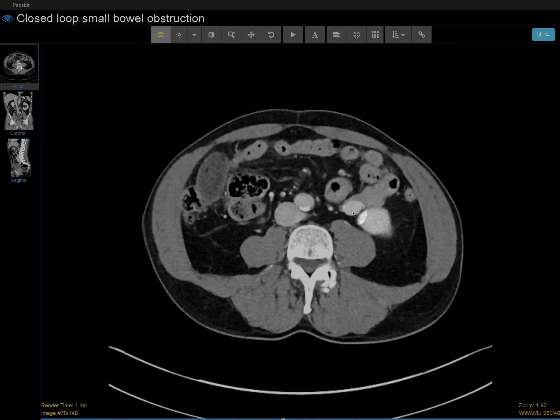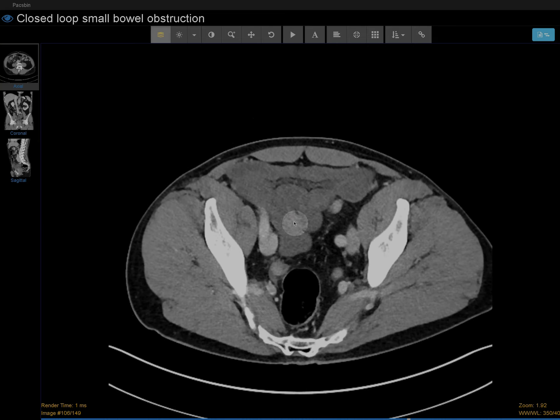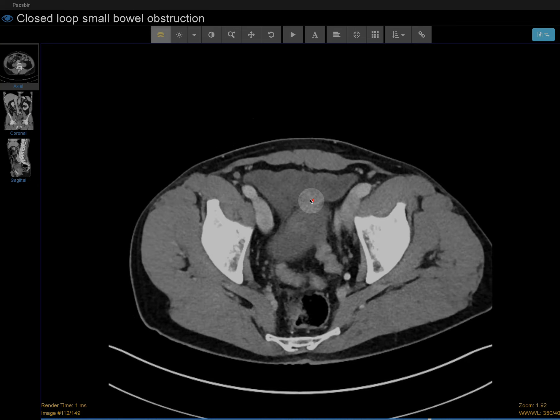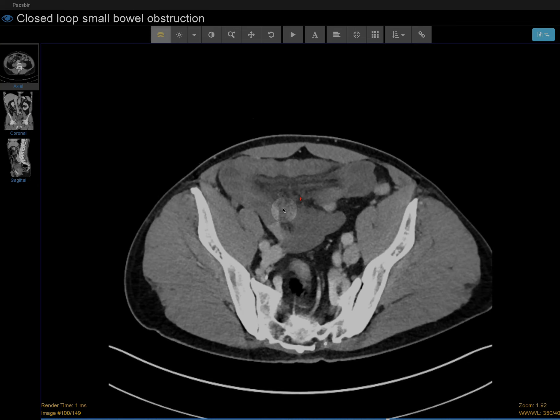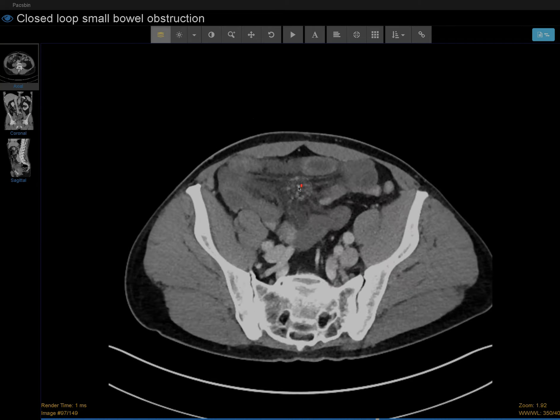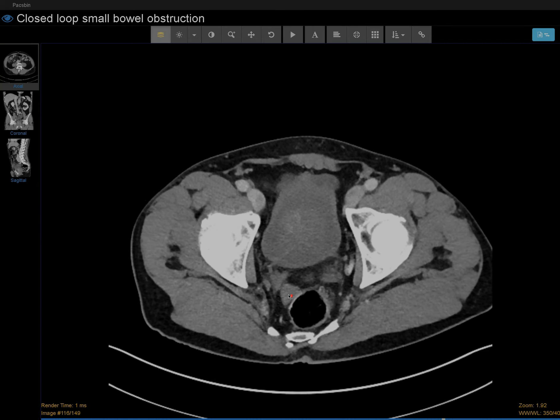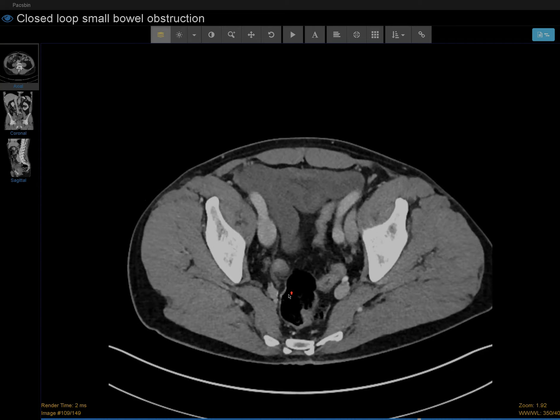For example, if you compare how these loops of bowel wall are enhancing to this area, there's a lack of bowel wall enhancement. On top of that, there's fatty stranding in the mesentery. So these bowel loops do appear abnormal. There is a small amount of ascites down here in the pelvis.